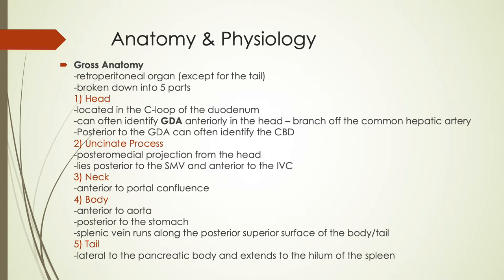The head of the pancreas is located in the C-loop of the duodenum, which can make it quite tricky because bowel gas and ultrasound are not friends. The other relevant anatomy in the pancreatic head that we can identify on ultrasound is the gastroduodenal artery, seen anteriorly, and posteriorly we can see the common bile duct. You guys have already been practicing elongating the bile duct into the pancreatic head, so that should be no surprise.